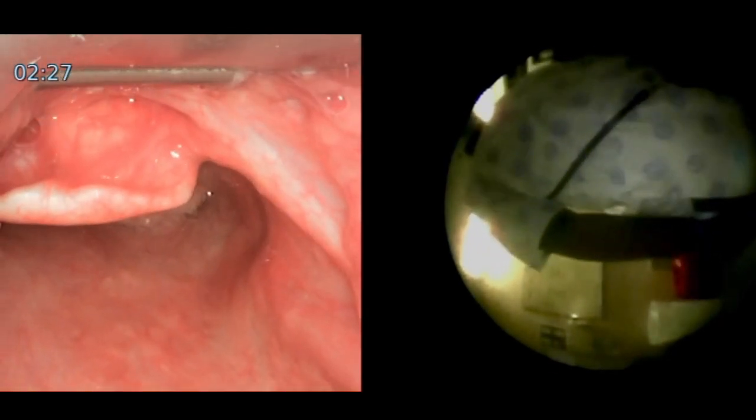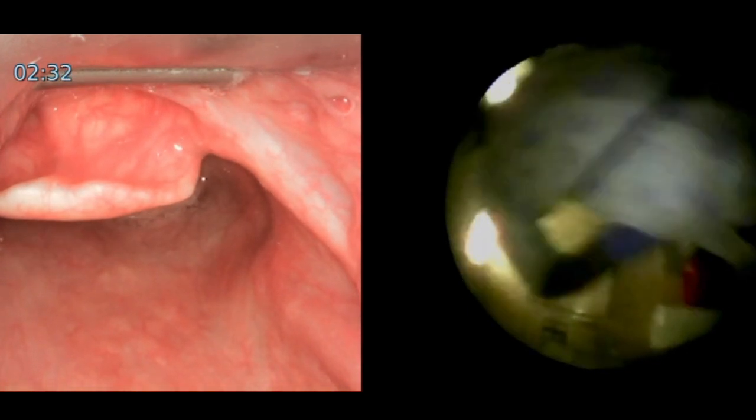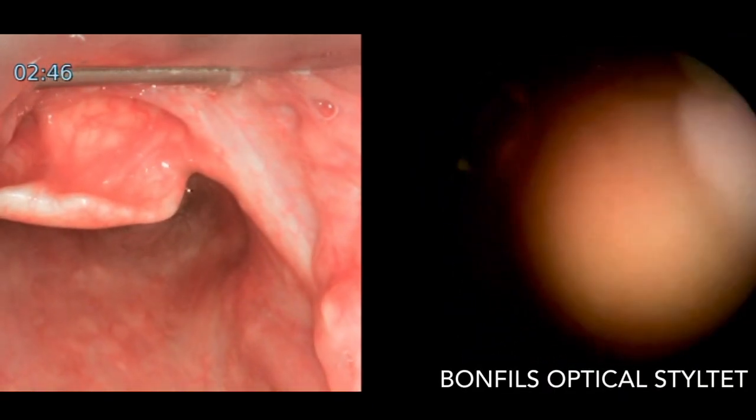This patient doesn't have a predicted difficult airway, but we're simulating difficulty with a Cormac Lehane grade 3 view. Picking up the Bonfilz with the tube preloaded, we're going to use the video laryngoscope to get us into the oral cavity.